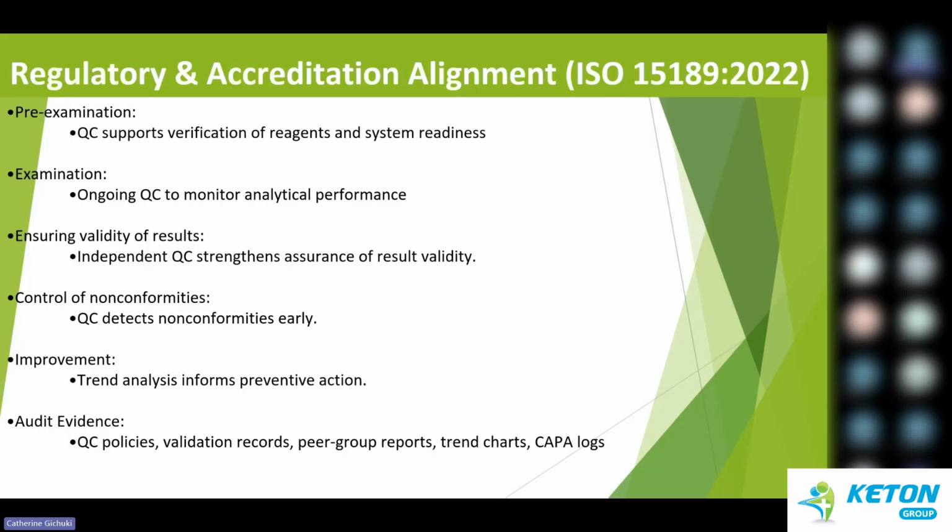When we engage in third-party QCs, we are able to see all these come in. The validation records are traceable to a certain matrix, and even to higher defined standards, and we will look into the things that are required and produced during audit.